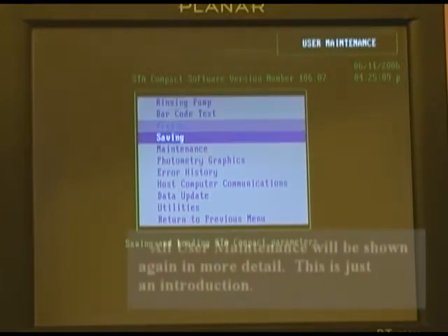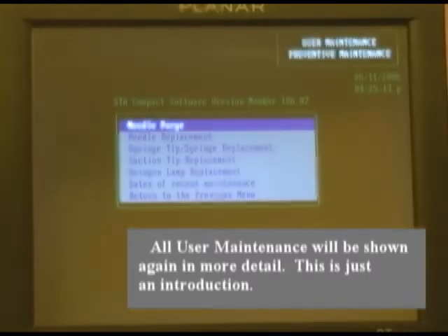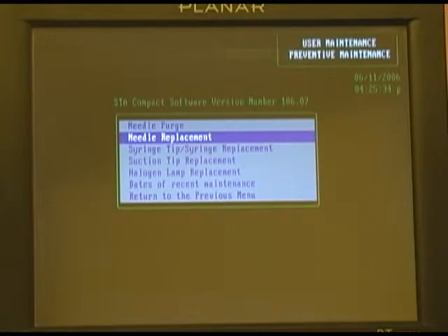Moving right along. Maintenance. These are the consumable items that need to be replaced on a routine basis in order to keep your system functioning at a high level. We can start off with needle replacement, and we would need to do a needle replacement whenever a needle becomes damaged or worn such that your recovery of results and precision are compromised.